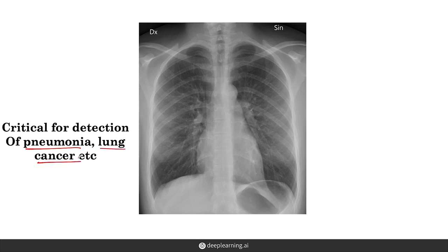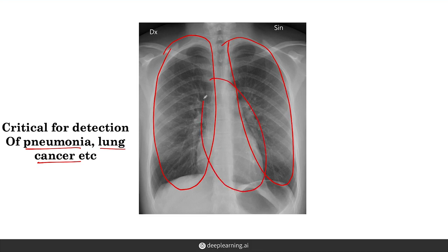people worldwide each year. Now, a radiologist who is trained in the interpretation of chest x-rays looks at the chest x-ray, looking at the lungs, the heart, and other regions to look for clues that might suggest if a patient has pneumonia or lung cancer or another condition.